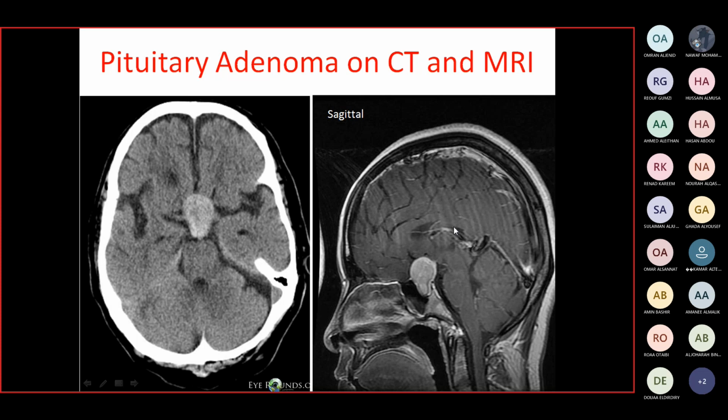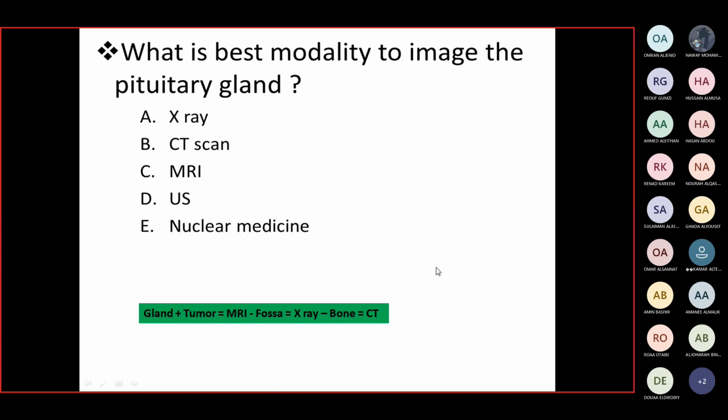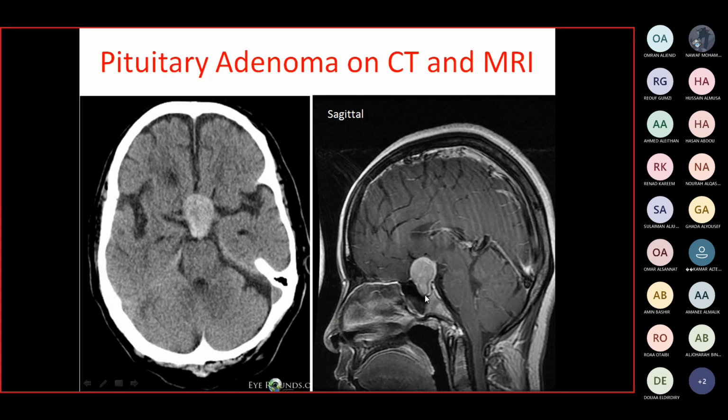You are not responsible for the pathology, but I present this image to compare the normal area of the pituitary gland in CT and MRI in the previous slide, to compare it with the abnormal region of the pituitary gland. Those are MRI and CT.